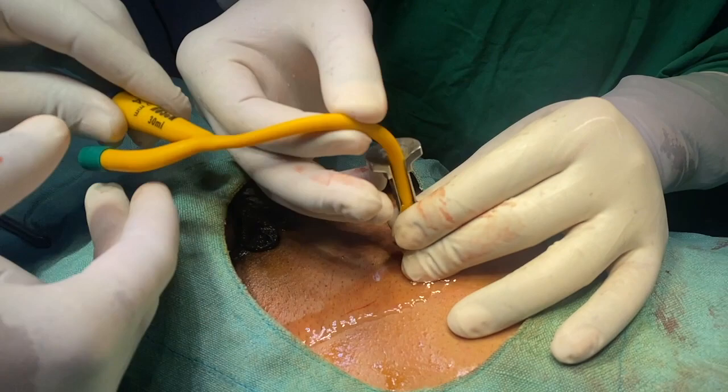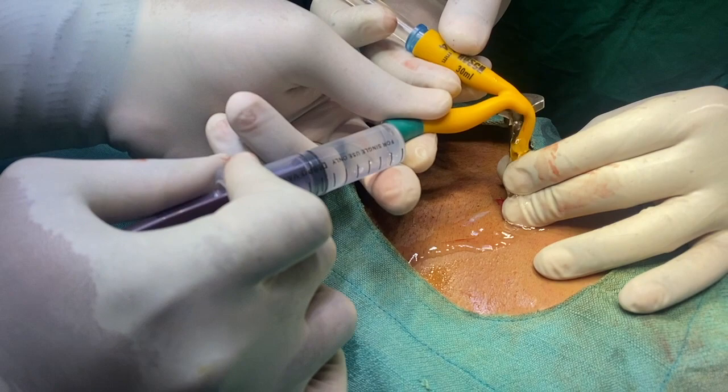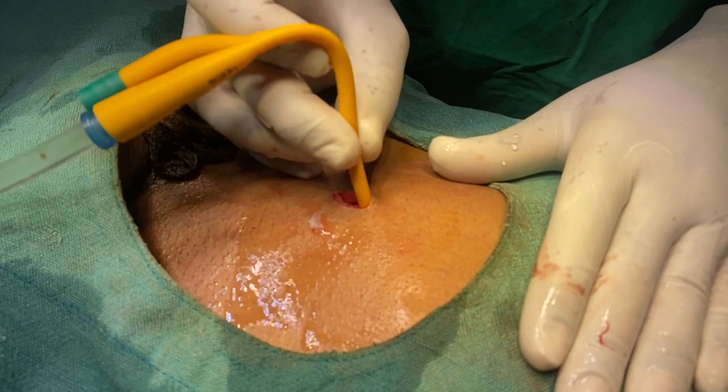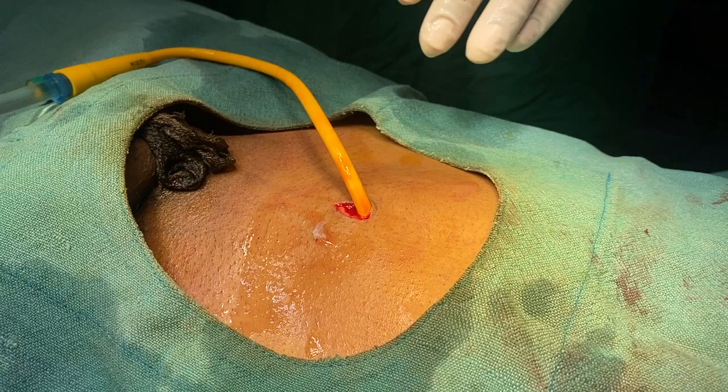The catheter should go in easily and almost completely. Urine is coming into the urine bag. We are now inflating the balloon. Once the balloon is inflated, we remove the half trocar sheath like this and confirm the easy movement of the catheter. I am not pulling the catheter completely — I am keeping some length of catheter inside the bladder in case the bladder gets deflated, so the catheter is not pulled out.